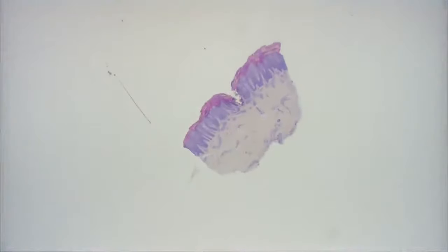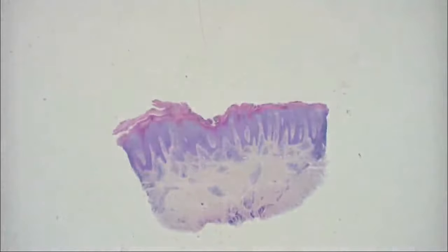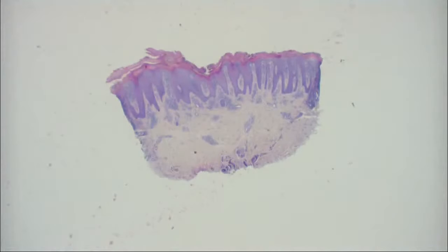The next one, if you guys don't get this right, it's like tragic. So we have maybe a shallow punch biopsy. Yes. Just looking at it from low power like this, you can see that there's parakeratosis. It looks like a lot of acanthosis. Yeah, good. And I think it looks like a lymphocytic infiltrate, a superficial perivascular lymphocytic infiltrate as well.